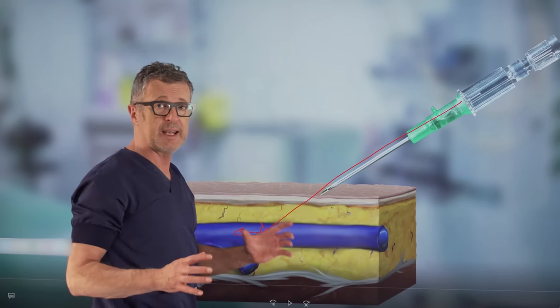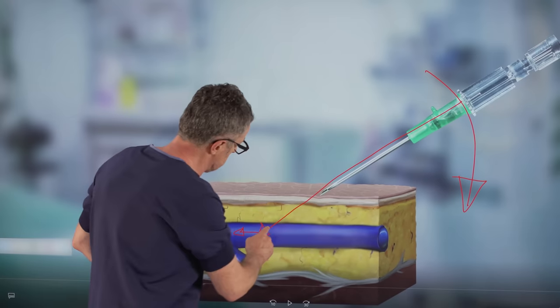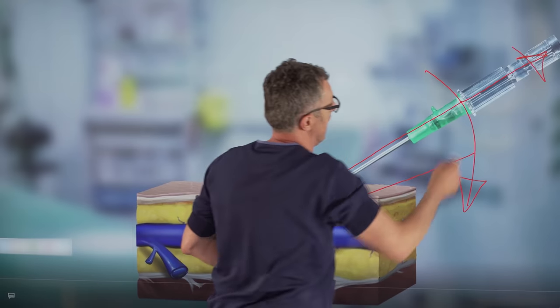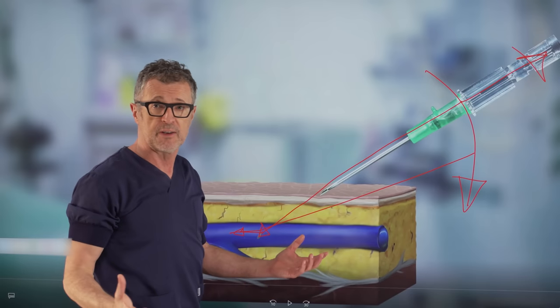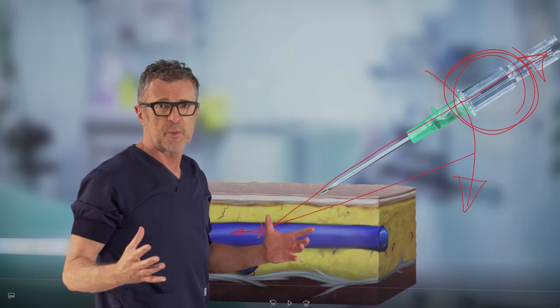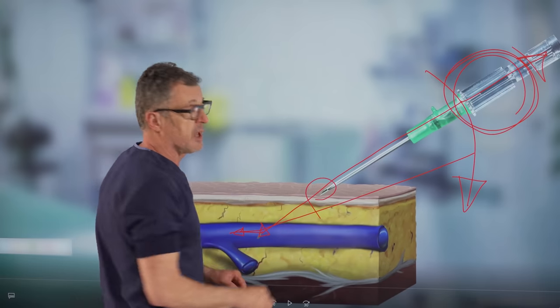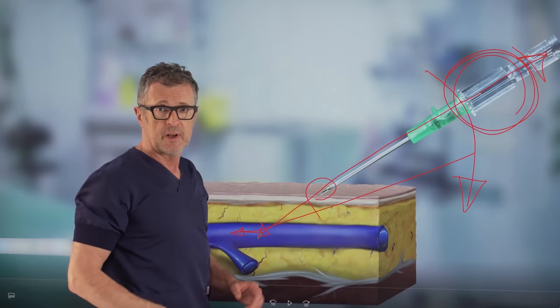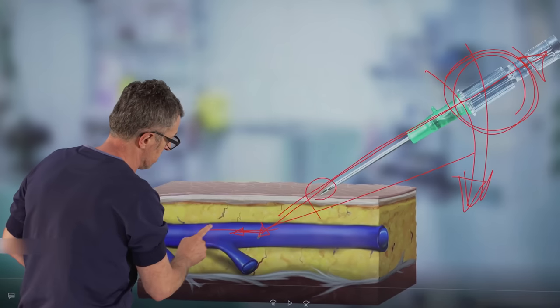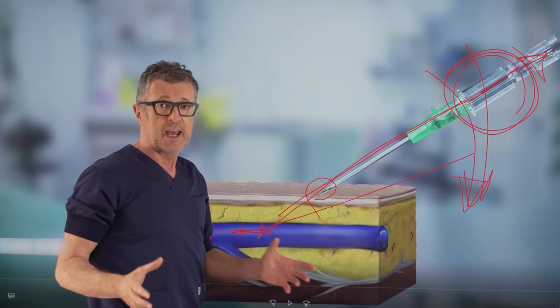Once inside the vein, you want to advance the needle catheter system a little bit deeper. But the only way to make that advancement is to lower the angle of the needle catheter insertion so you can place that needle catheter system deeper and then you simply take the needle out, leaving the IV catheter inside the lumen of the vein.